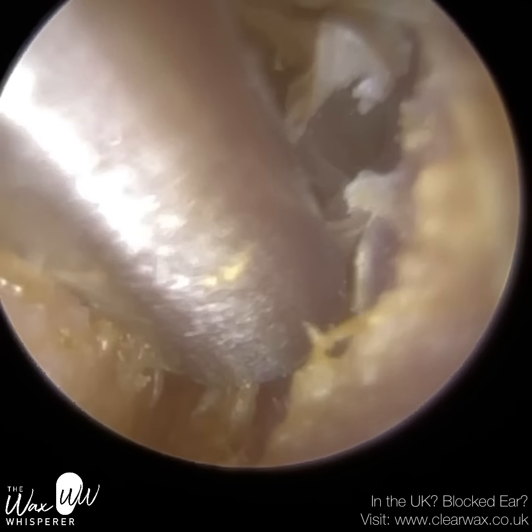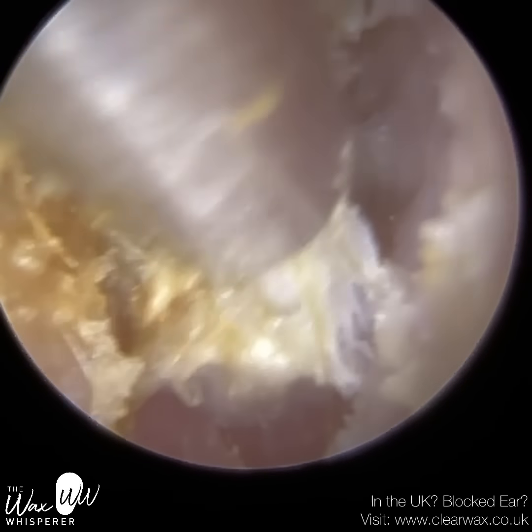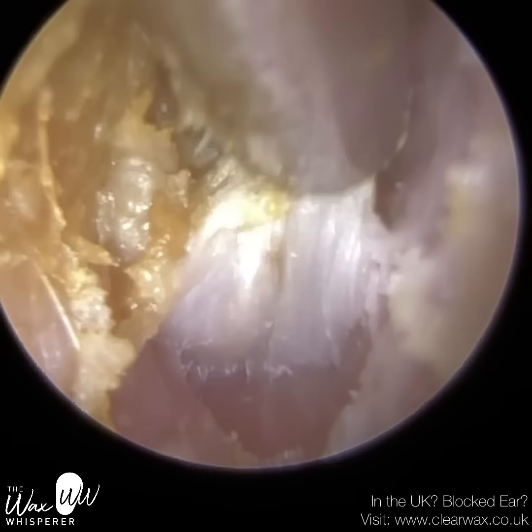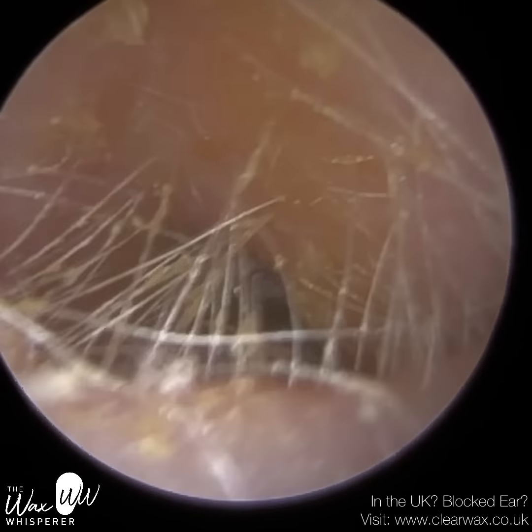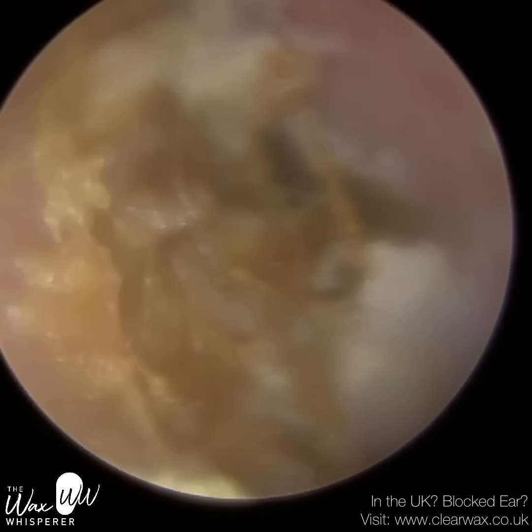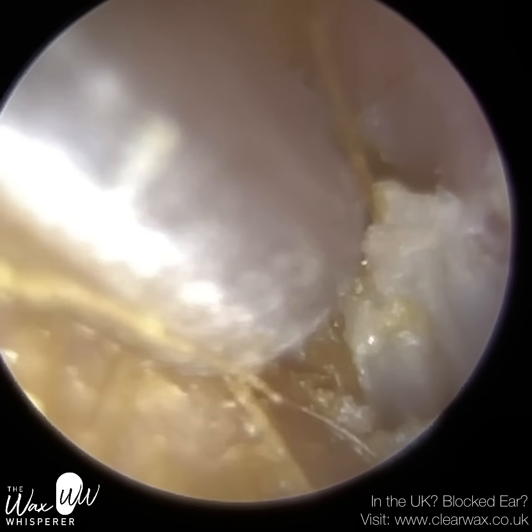So it's very sticky and wet on this side. Not much space to work with because it's a lot of edema and swelling. And it's just blocked the tube there. And once more, I want to avoid using any drops if at all possible. Whenever the ear is infected like this, I prefer to avoid drops wherever possible.